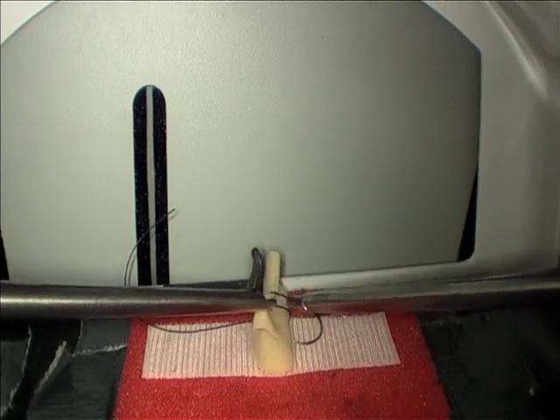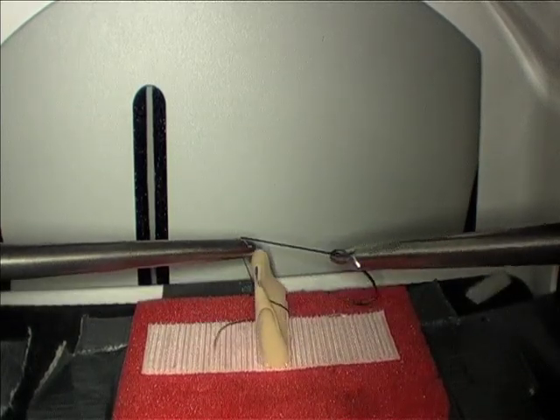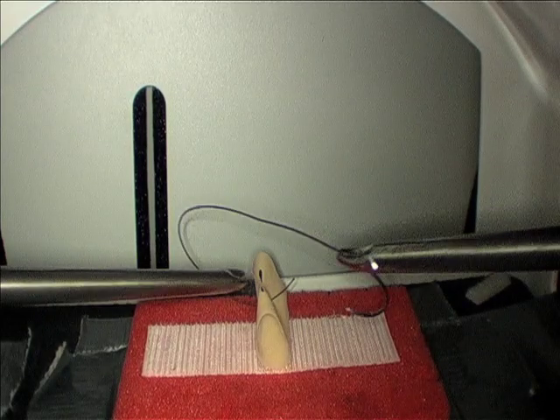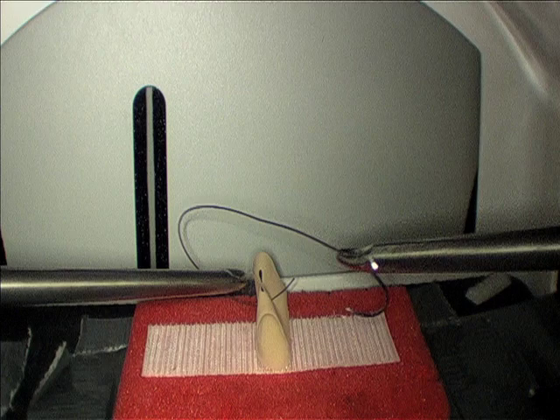Next, grab the suture in your right hand so that the suture is coming out of the tips of your needle driver. Bring the suture through, leaving a short tail, and create a C loop with your right hand.